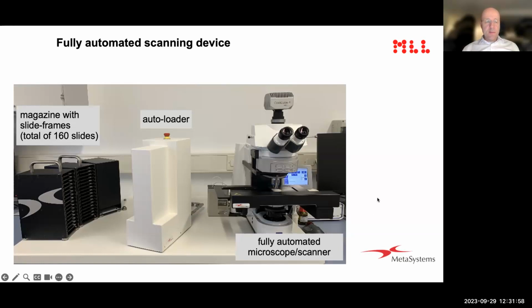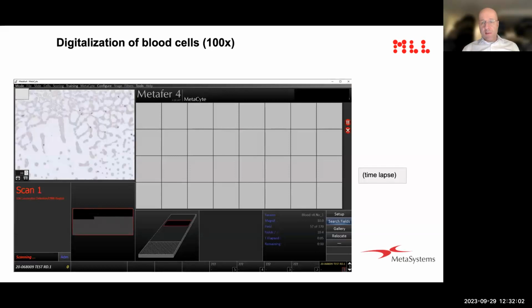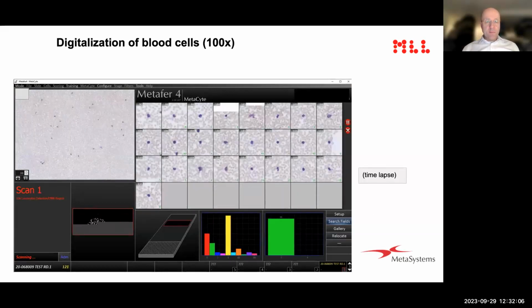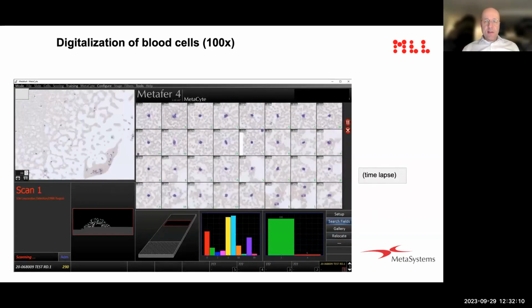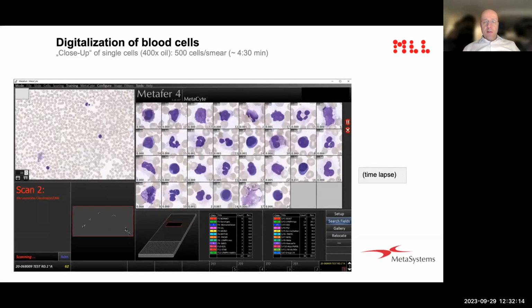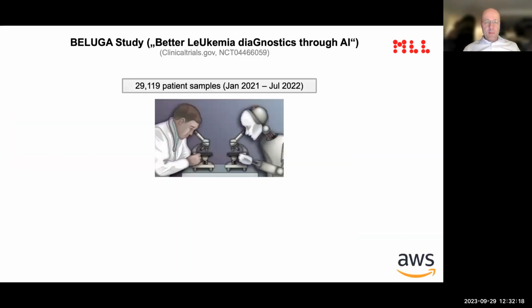And what has been applied to cytogenetics since ages, we have now, as others have also done, applied to peripheral blood smears with the aim of identifying cells, and not only the normal cells, but also the malignant cells, as you see here in a part of the pictures.